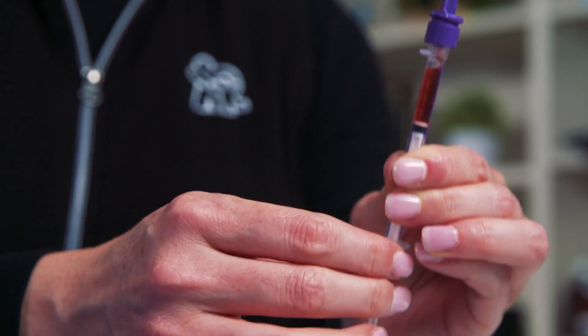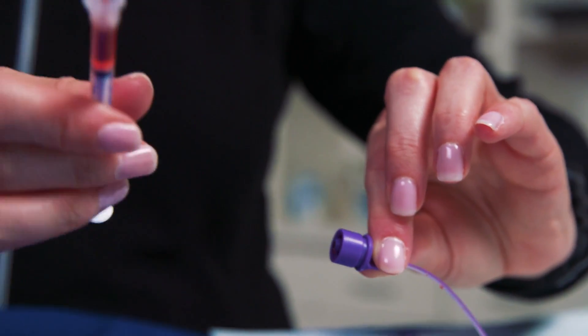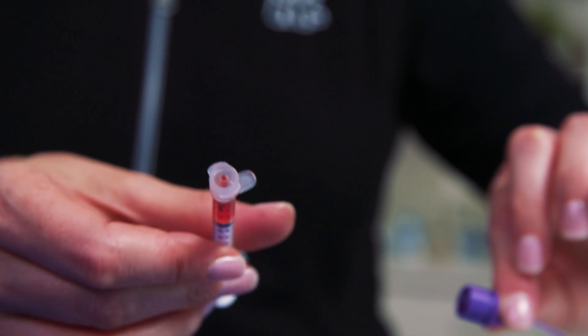Air bubbles from the straw may fill the lower end of the syringe. Carefully tap or flick the syringe to remove the air bubbles before disconnecting the medication straw. Once you disconnect the medication straw, ensure there's no excess medication in the moat. Another option is to fill the syringe without an NFIT medication straw.